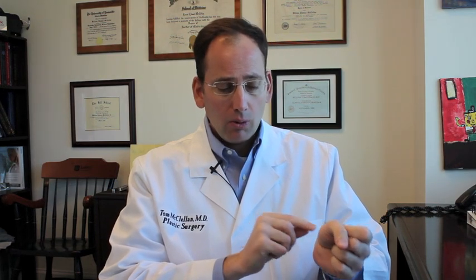We remove that, we bring this flexor carpi radialis into the wound, we reconstruct the palmar oblique ligament of the thumb with this tendon, and then we roll the tendon up into what's called the anchovy — this is often called the anchovy procedure — which is basically a spacer.